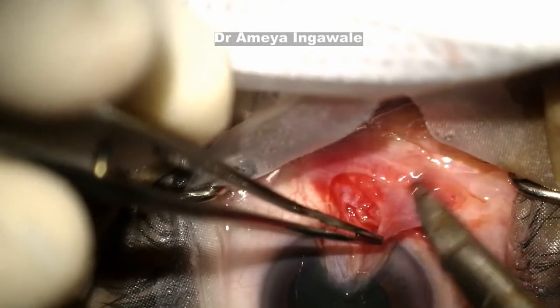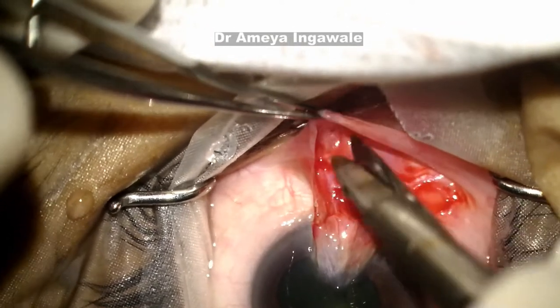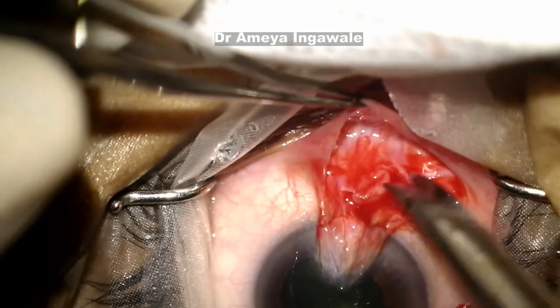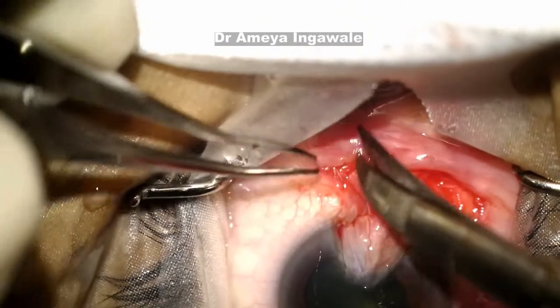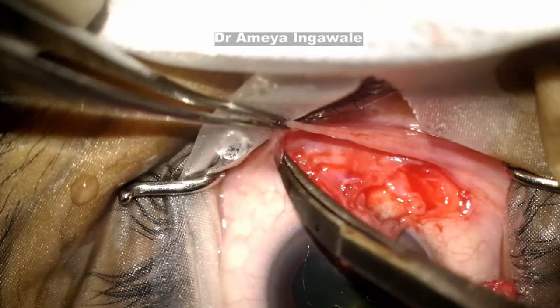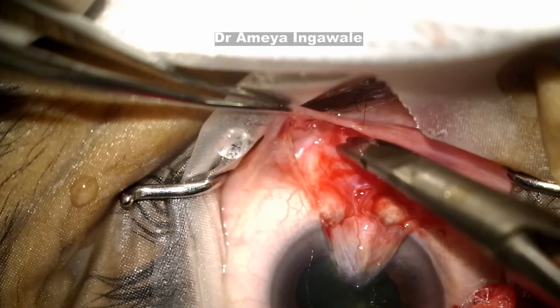The lateral border is identified by the pink and white junction. In this case I am going a little deeper — as I go deeper, the deeper parts appear white, whereas the proliferative conjunctival tissue appears more pink. Make sure you don't miss any of the lateral extensions, otherwise you will have growth starting again from there.